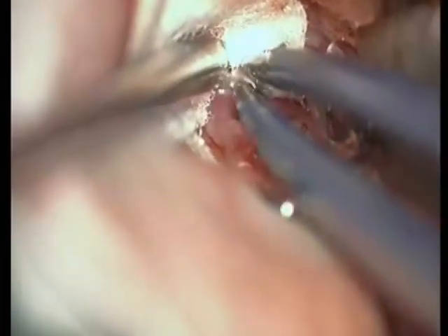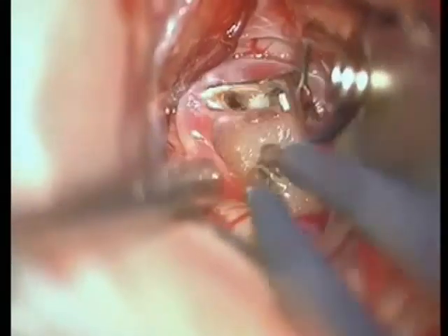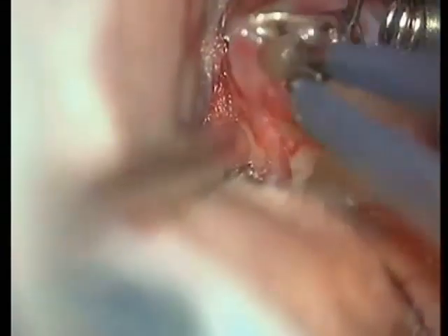ICG is done once again. There is still contrast visible from the previous injection, but once the new bolus arrives, we can see that all the arteries are patent and the aneurysm is occluded. Papaverine is applied again.